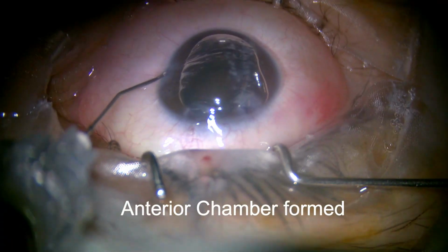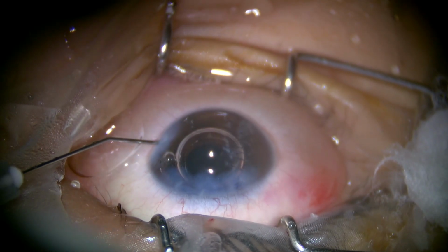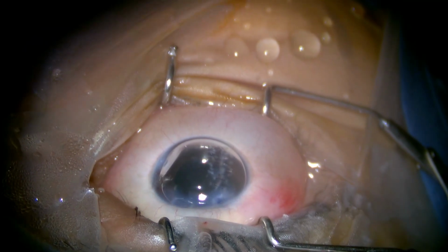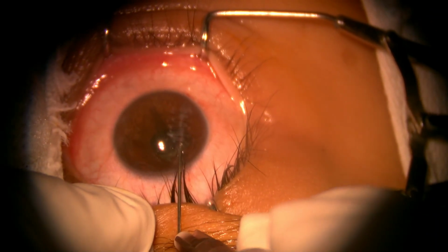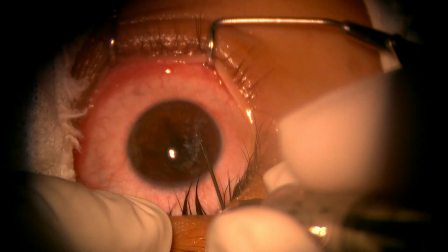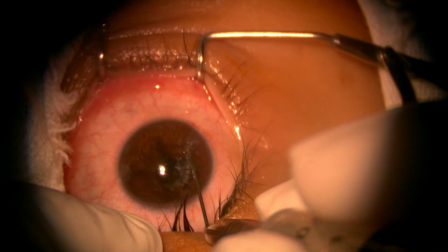Air is injected to form anterior chamber and the case is closed by side port hydration and subconjunctival injection. After 45 days, all the sutures are removed under topical anesthesia one by one, as we can see in the video.